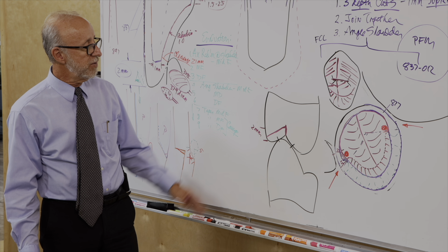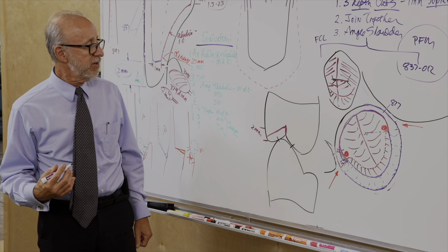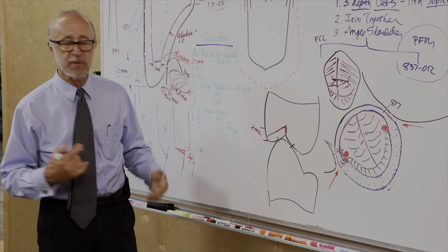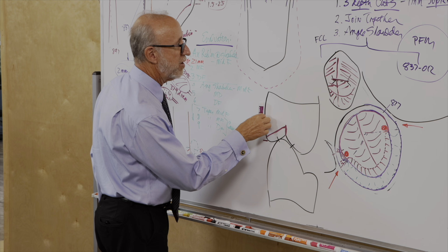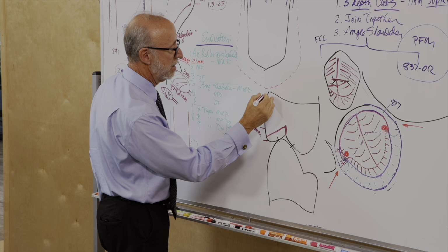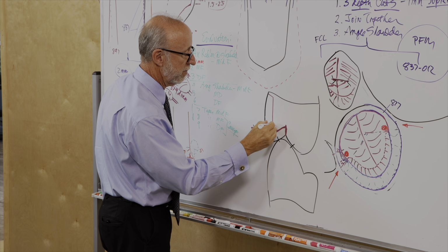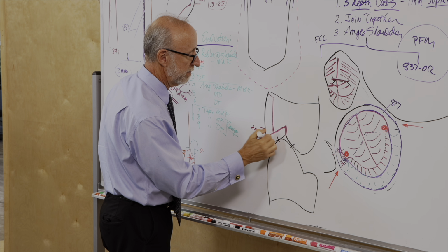Then we could do the rest of the occlusal, or we could do the facial reduction. So let me talk about just doing the facial reduction now so you see how it fits together. So how do I do the facial reduction? Three depth cuts, join together, angle the shoulder. Okay, same thing. So we have an angled shoulder, taper matching the middle third, secondary plane.